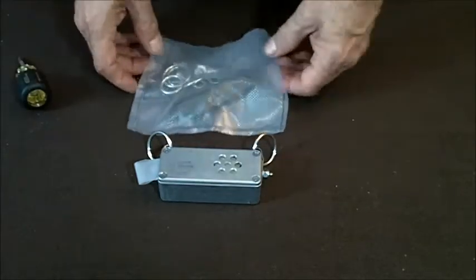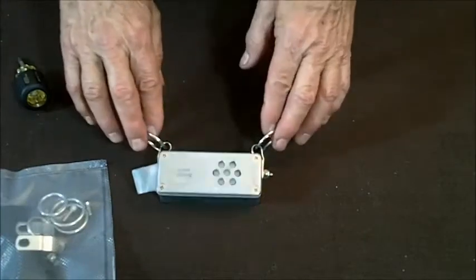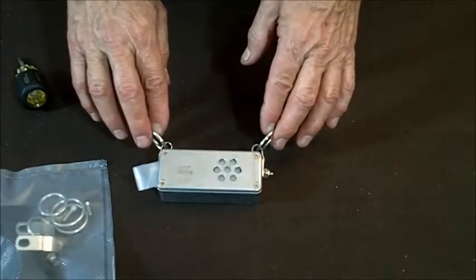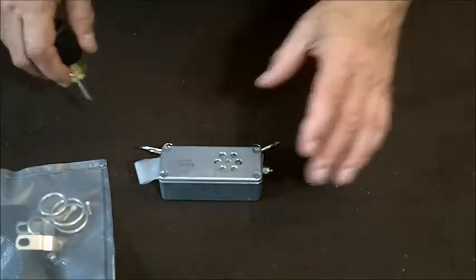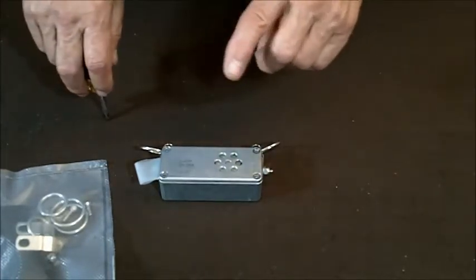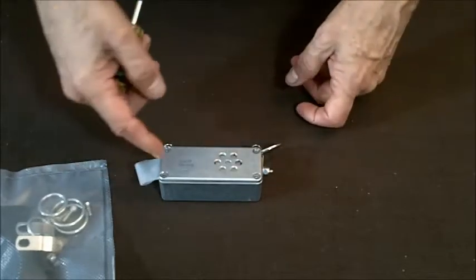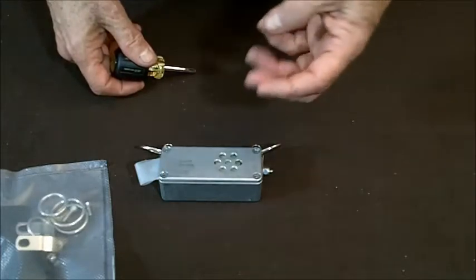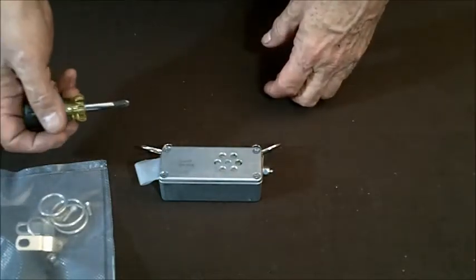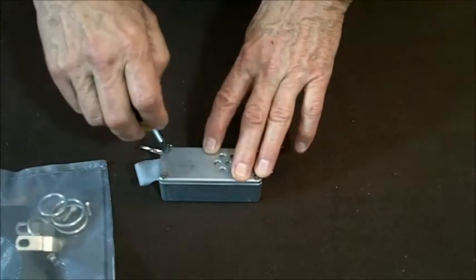When you get the unit and you set the spare parts on the side, I'll get into that in just a moment, and you've got the BlindSight unit itself. To activate it, which just means to turn this thing on, what you need to do is let the batteries make contact. This strip of plastic is preventing one end of the battery stack from making contact with the battery contact, so we have to pull it out of the way. To do that, all you need to do is loosen the 4 screws, a couple of turns, really.